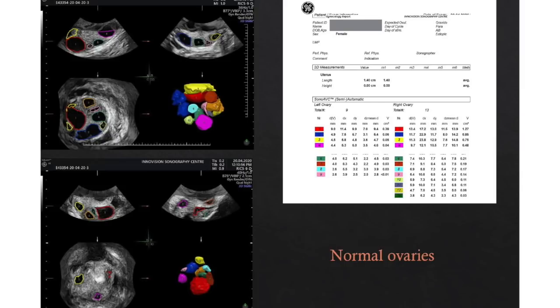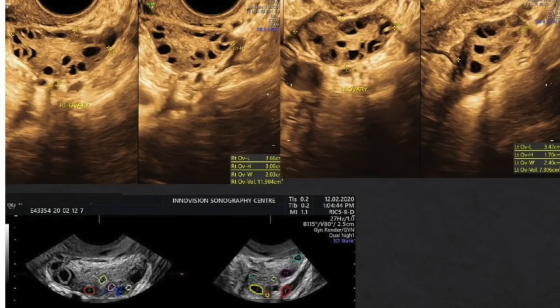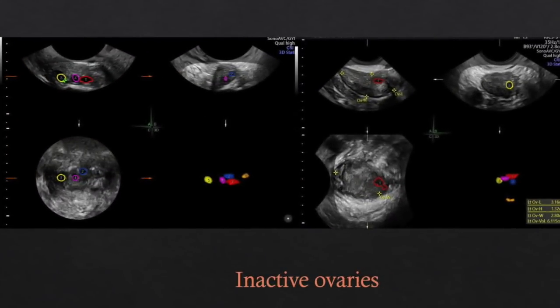Some machines have 3D technique available with very accurate tools such as inversion mode, where follicles are seen as colorful solid balls, SONO AVC for automatic volume calculation of AFC, and VOCAL for ovarian stromal volume calculation and various vascular indices. In 3D, a detailed report is auto-generated mentioning number of follicles, dimensions, and volume of each follicle. For example, normal ovaries on baseline scan may show 13 follicles in the right ovary and 9 in the left; polycystic ovaries show 25 in the right and 17 in the left; and inactive ovaries show AFC 4 to 5 in both.